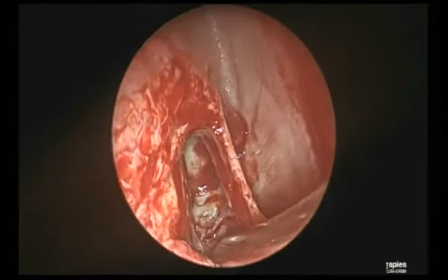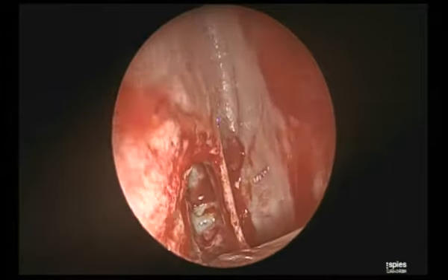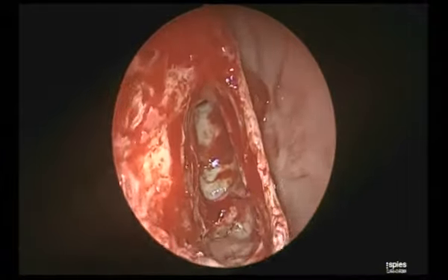The message is, as long as your bulla remains intact, forget about the anterior ethmoidal artery. Clear? Now that I just removed the upper part of the bulla to show that space, give me the reverse part.